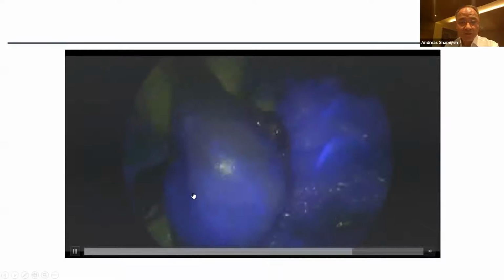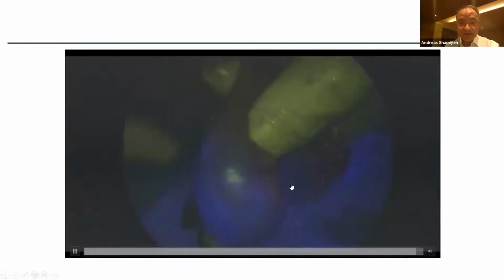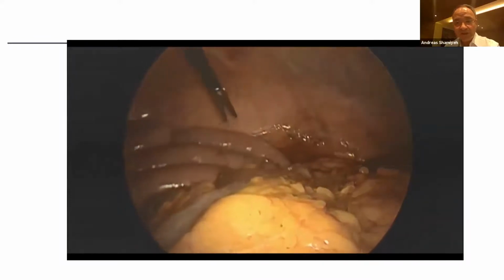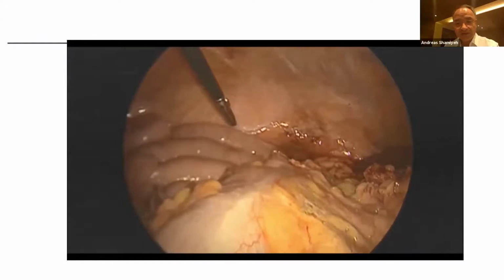And even in the small bowel, sometimes you have a bad blood supply, which shouldn't happen. However, we analyzed the literature, and we found that you might find more leakage on right hemicolectomy than in left hemicolectomy, and maybe sometimes it's due to the small bowel. And of course, you can do it also intraoperatively if you want to check the anastomosis.